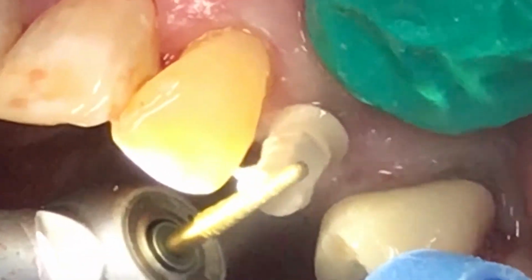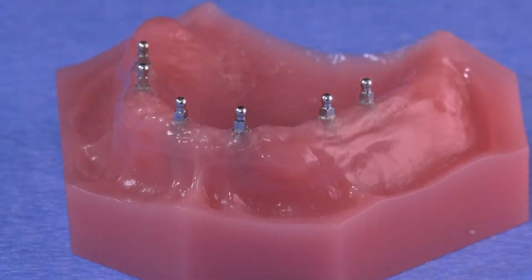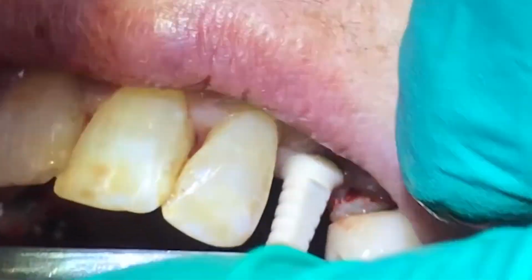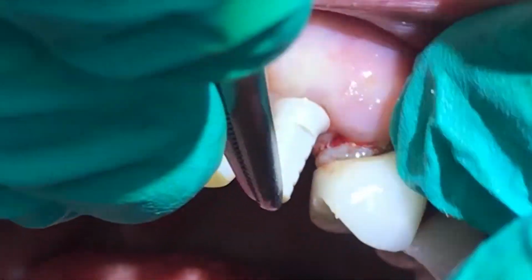They are snap fit onto the mini dental implant, and the square, the flat area on the face of the TrueLock abutment lines up with the square of the mini dental implant. So you want to make sure you line those up and then snap them into place. Sometimes they can be a little difficult to get in, but once you snap them in, they're on there pretty good, and then we don't want to have to take them off again.